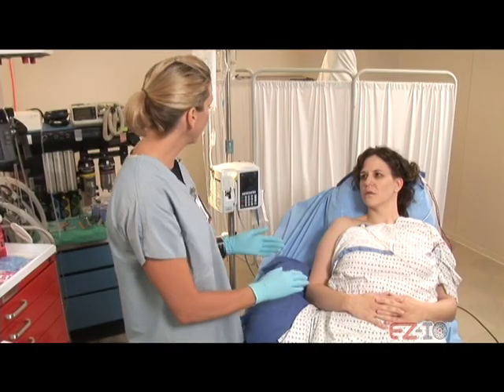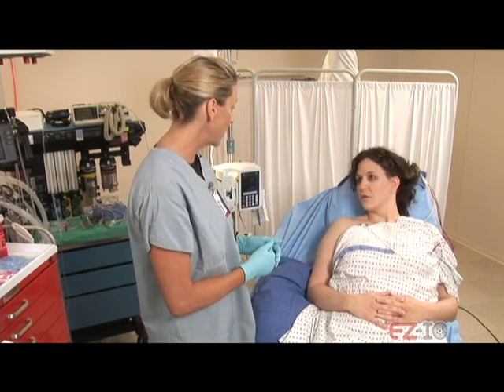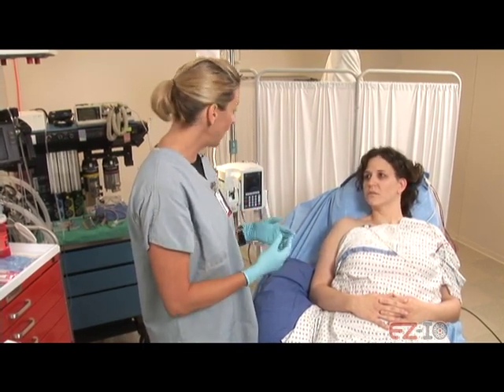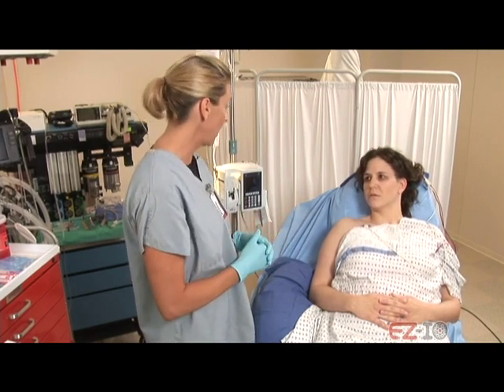Okay, so Karen, we were not able to get IV access, so what we're going to do is get vascular access by putting it into the bone. So what you're going to feel is it feels a lot like an IV when it's going in. You're going to feel a little bit of pressure when it's going into the bone, and then I'm going to give you some medication once it's in there that's going to help to numb that area up so you won't feel anything after that, okay?